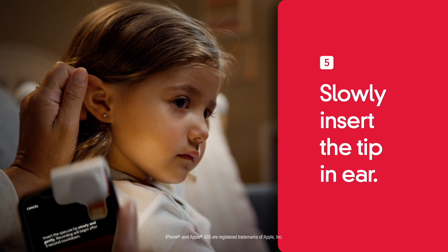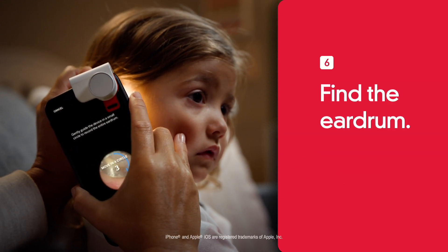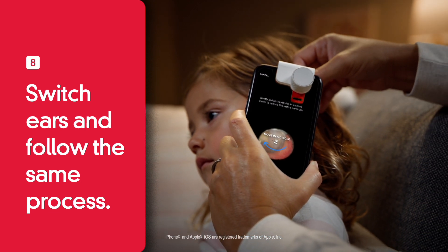Next, slowly insert the tip into the ear. Be gentle. Find the eardrum and capture a recording of the eardrum. Then switch ears and follow the same process.